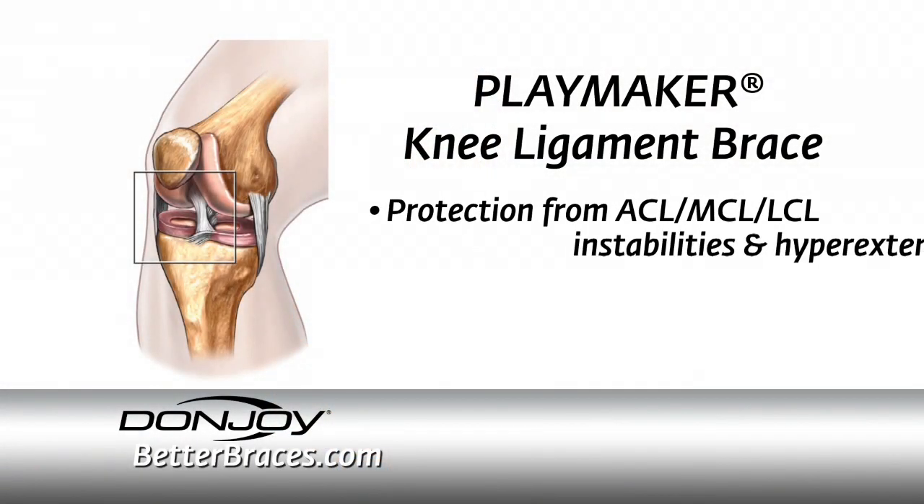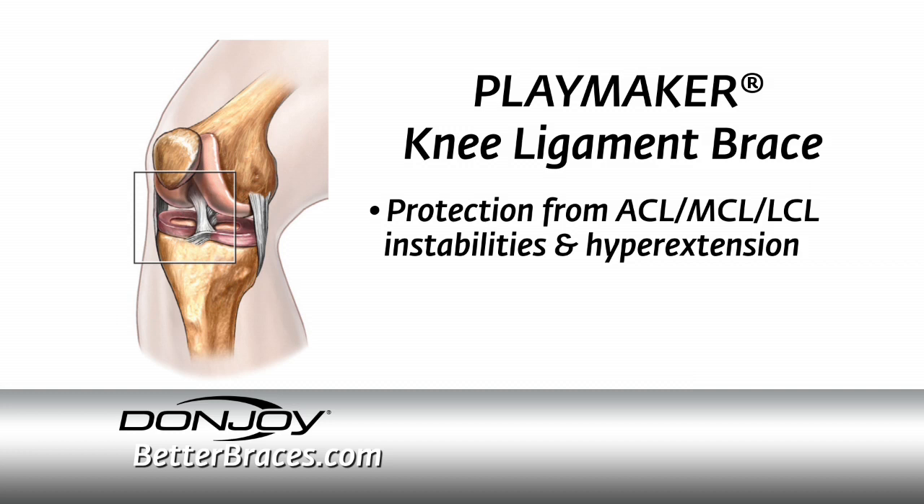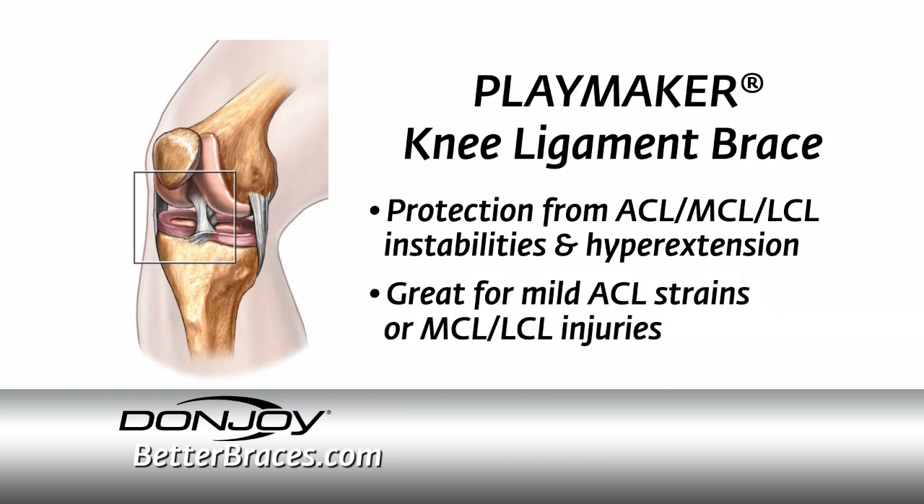The DonJoy Playmaker is a soft knee ligament brace for contact and non-contact sports and activities of daily living. It's ideal for injury prevention and protection for mild to moderate knee ligament instabilities and hyperextension. The DonJoy Playmaker is a great brace for mild ACL strains or MCL-LCL injuries. It provides the protection and support you need to get back in the game.